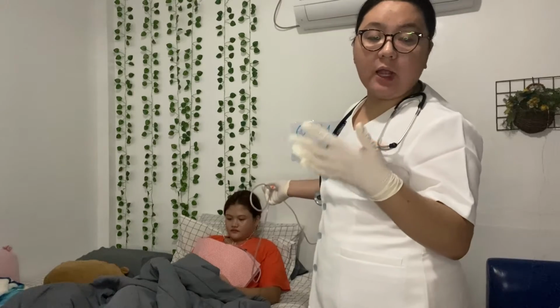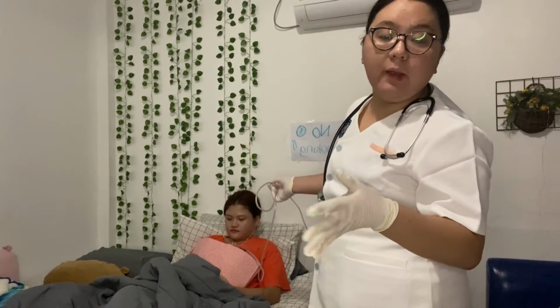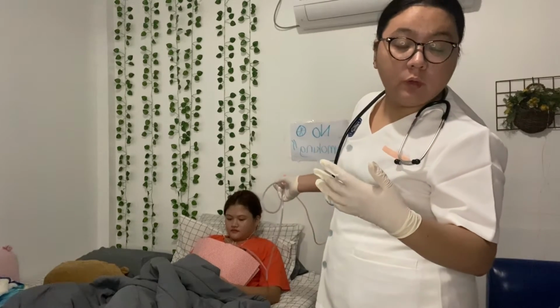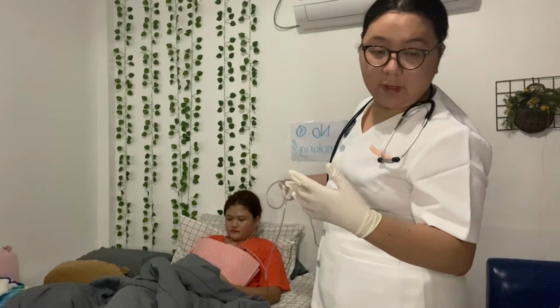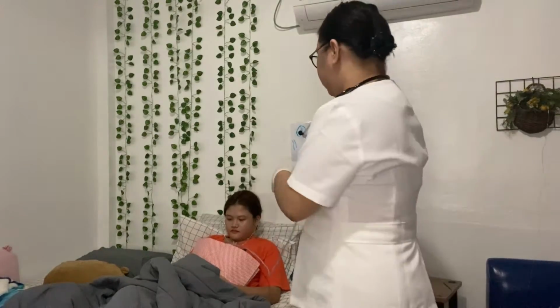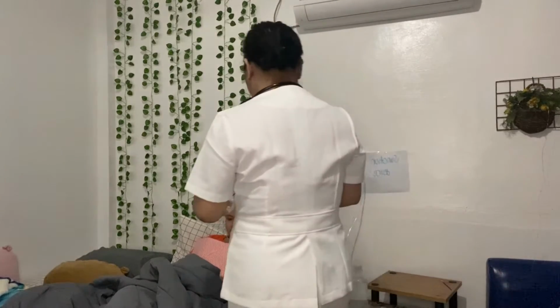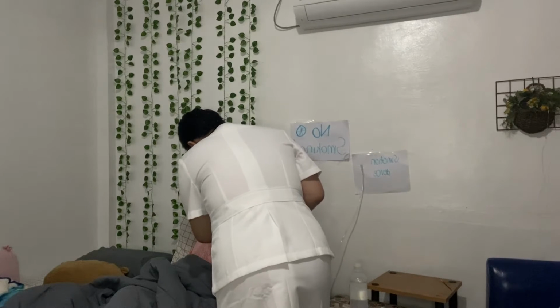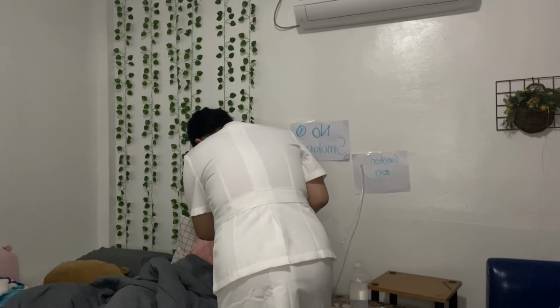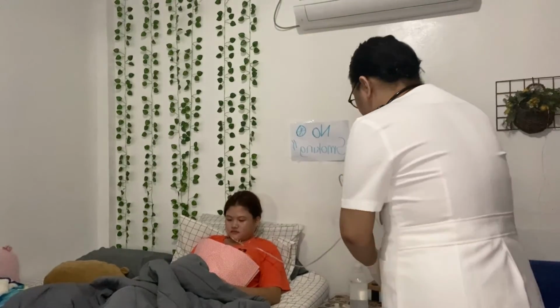Without applying suction, gently but quickly insert the catheter with the thumb and the forefinger into nares using slightly downward slant or through mouth. When clients breathe in, do not force through nares. Okay, going to lubricate early, and also get an amount of saline from basin.